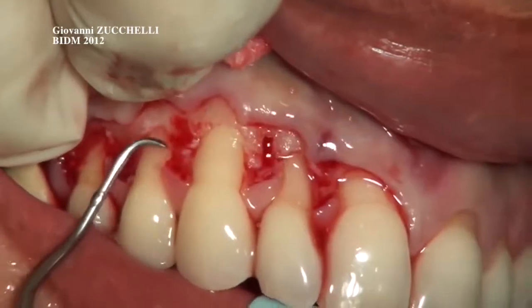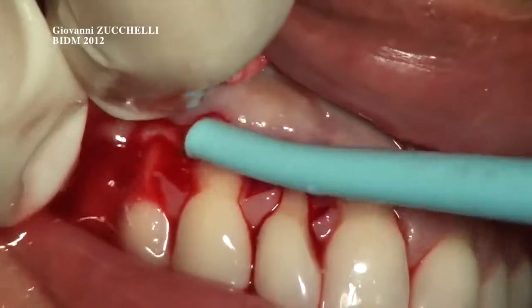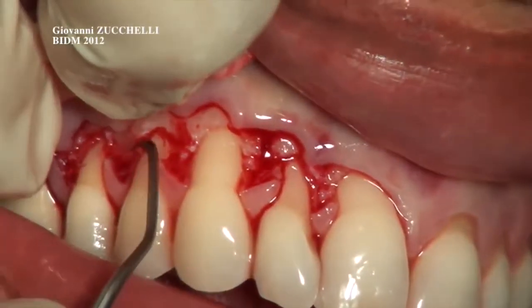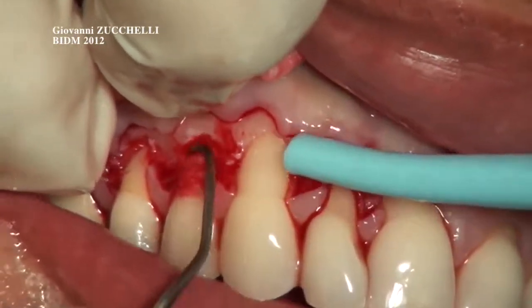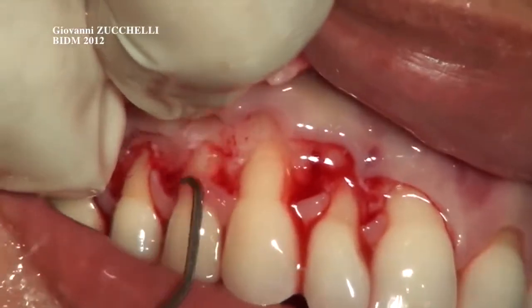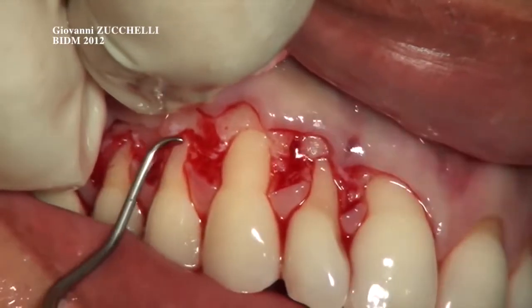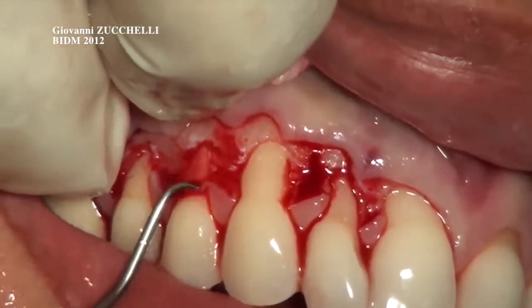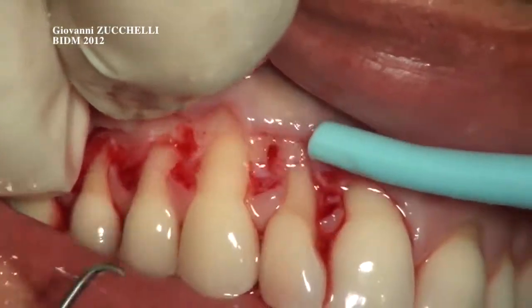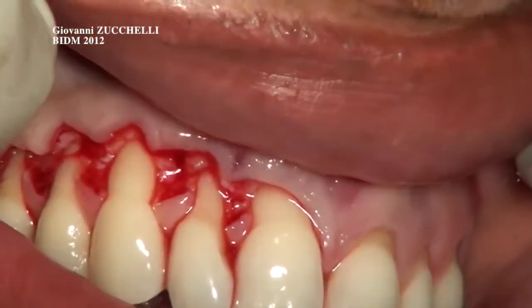And the quality of the attachment between the soft tissue and the root, which is a combination of the long junctional epithelium and connective tissue attachment, mostly depends on the stability of the blood clot which will form between the lining mucosa of the coronally advanced flap, coronally stabilized at the end of the surgery, and the root surface. Now the root is ready, change the gauze again.